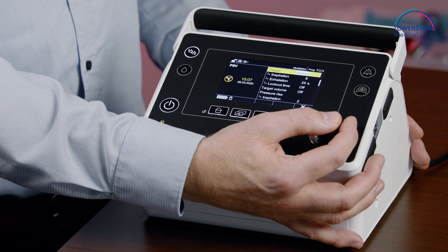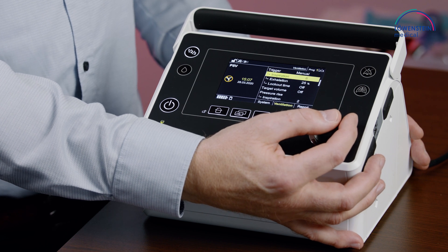And with trigger artifacts, the device will recognize these artifacts and will set the trigger to a more insensitive step. If we choose the manual setting, we can go to the inspiratory trigger.